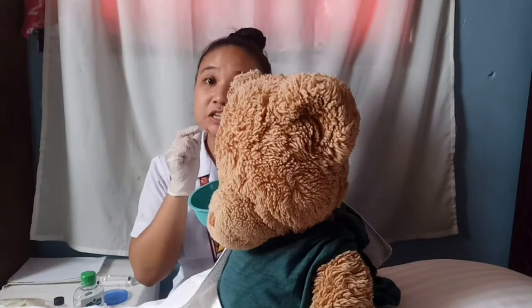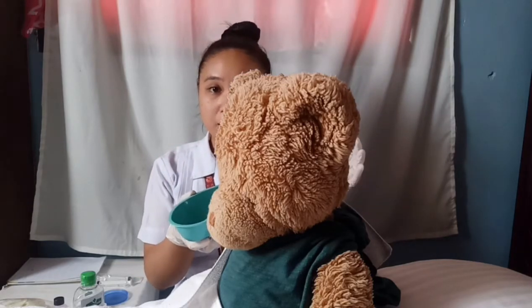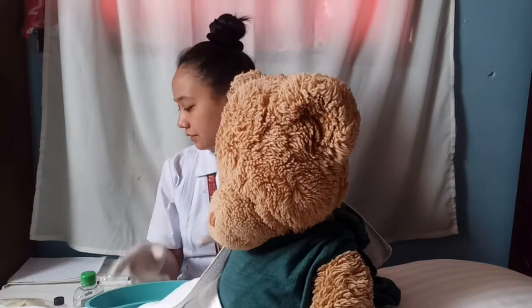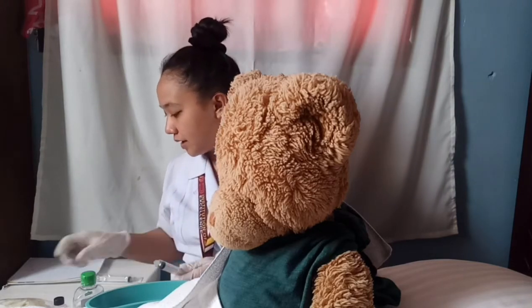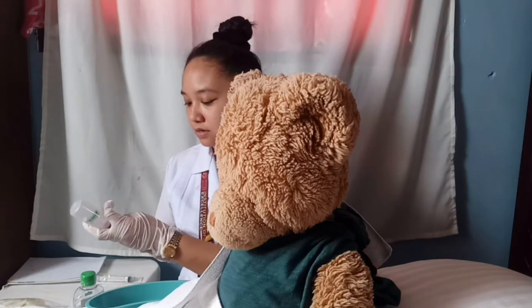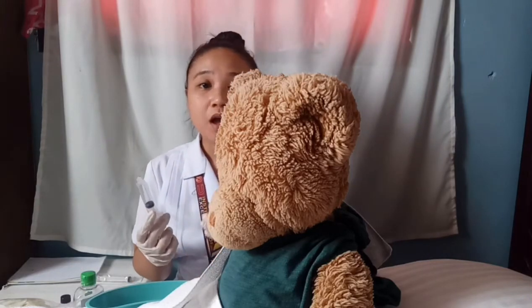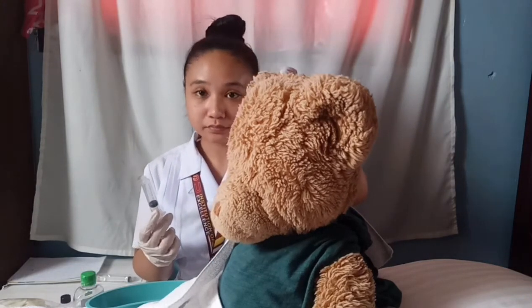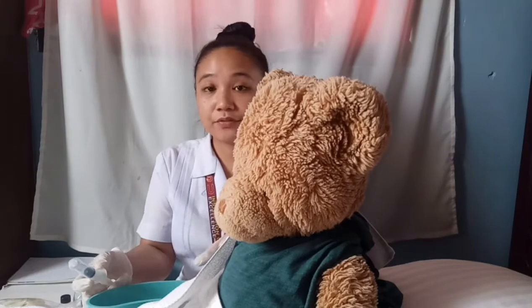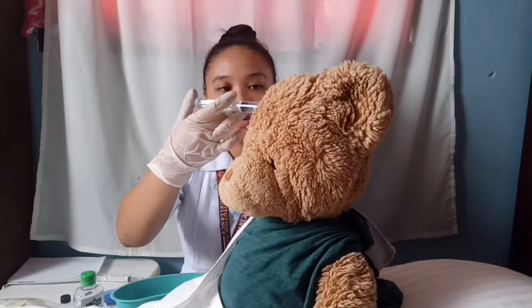Then you need to fill the syringe with solution, or you need to hang up the irrigating container and run solution through the tubing and nozzle. So get the syringe and then the irrigating solution and get some of it, and then you need to straighten the ear canal, and then insert the tip of the syringe into the auditory meatus. So let's say for instance this one is in here, okay? So we need to straighten this one.